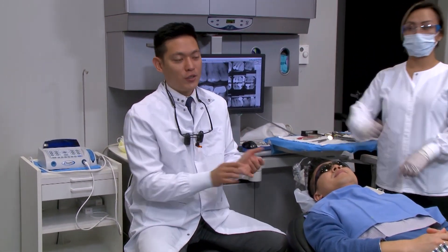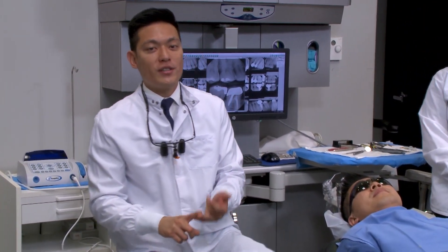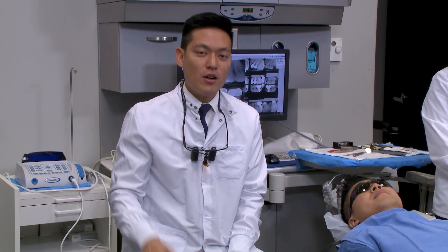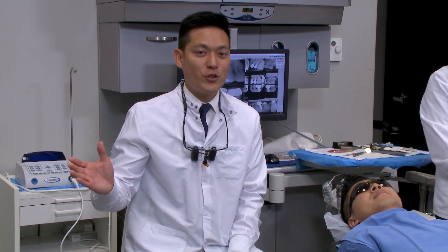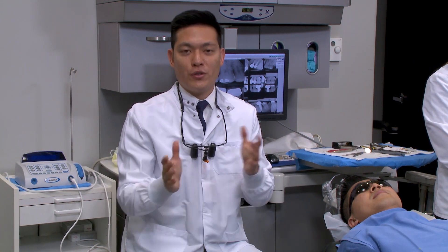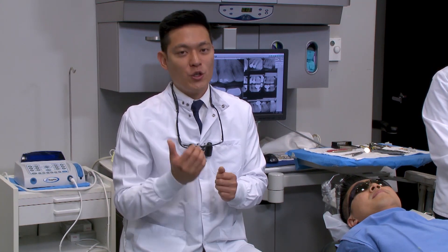Now that we have our digital impression — the prep, adjacent teeth, opposing, and the bite, that digital triple tray — we're going to transfer it to our digital design station, which is in the lab right next to us. Hang tight for a couple of minutes and I'll introduce you to how we design a case using Fast Design.